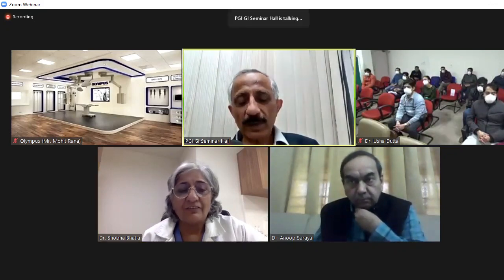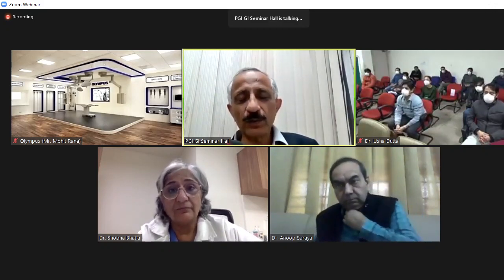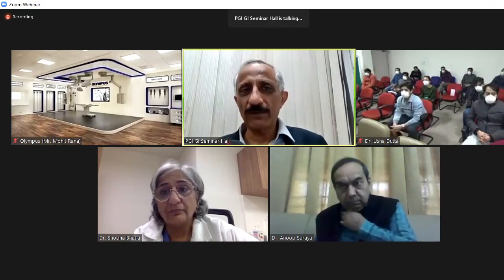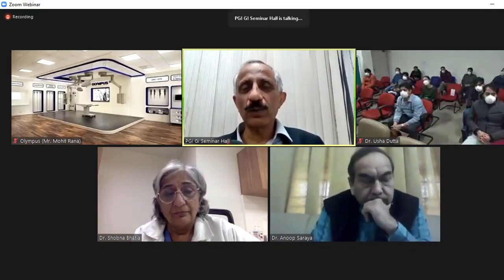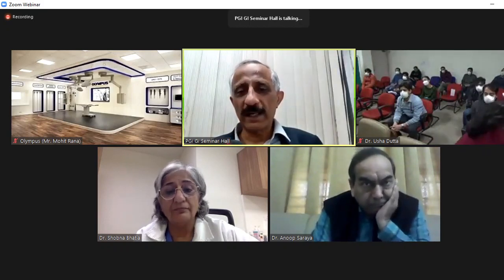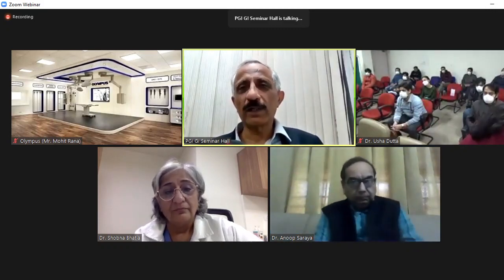Yes, I think you have very rightly said the crux of the thing. As a gastroenterologist, endoscopy is part and parcel of our training and our livelihood. And for the patient who undergoes an invasive procedure like endoscopy, this should not be taken lightly. This is an intervention by all means, and it has to be accounted for.